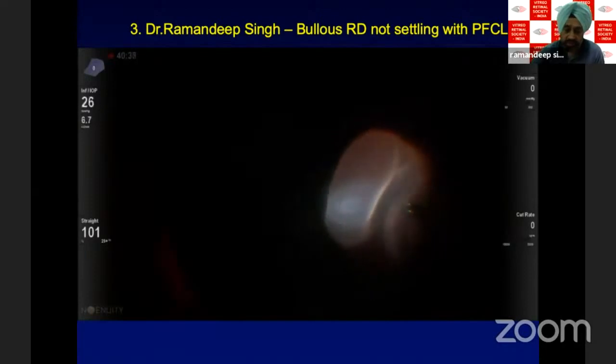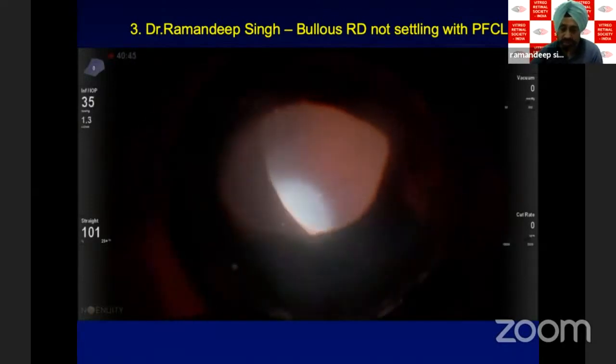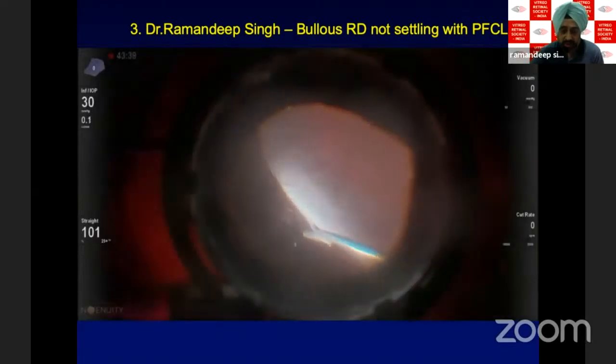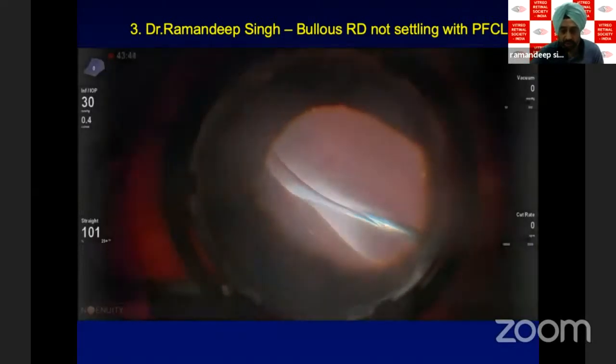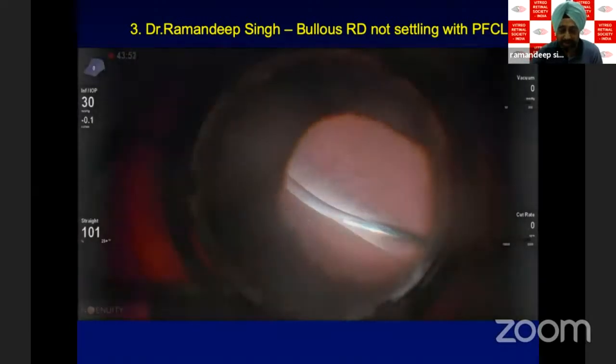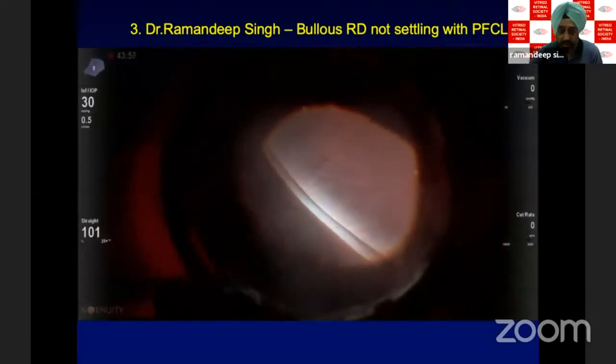So I saw very nicely what is happening around there. Is there oil in the periphery which has gone down? So I had no idea. So then that left me with no choice. I put the PFCL there, and with this PFCL, this retina is not settling down, and this is really mind-boggling, what to do next.